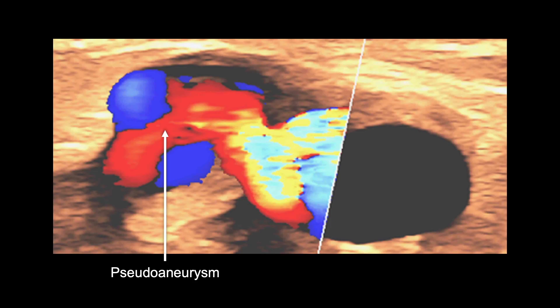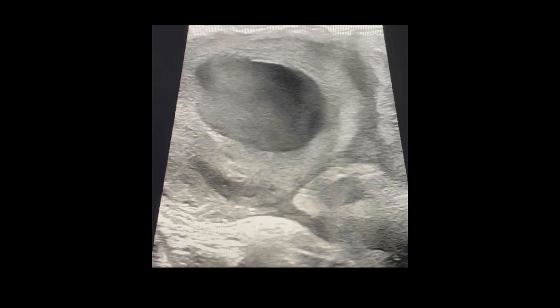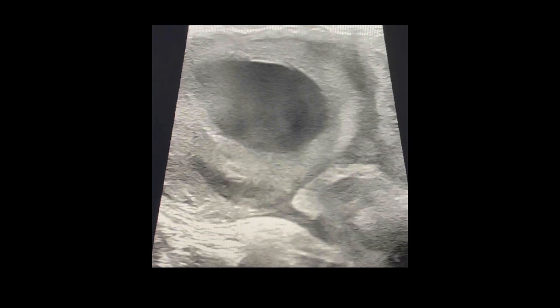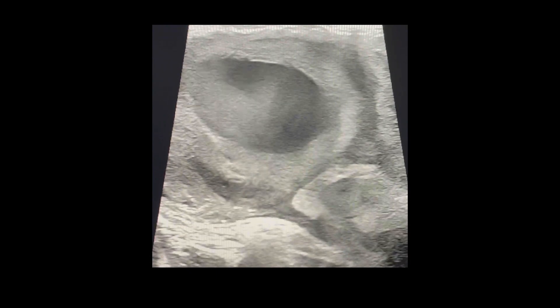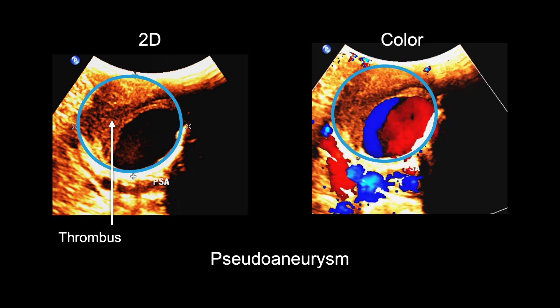In this image of a pseudoaneurysm, you can see both blue and red areas as the blood is swirling in opposite directions. Sometimes you can see the neck, or trail of blood, leading from the outflow vein to the blood collection in the tissue. This 2D video shows the slow-moving blood cells swirling within the pseudoaneurysm, which creates the yin-yang sign when color is applied. You can also see the to-fro of the cells in the neck on the bottom right. This image shows a pseudoaneurysm with thrombus in 2D on the left and then in color on the right, where you can see the yin-yang sign.